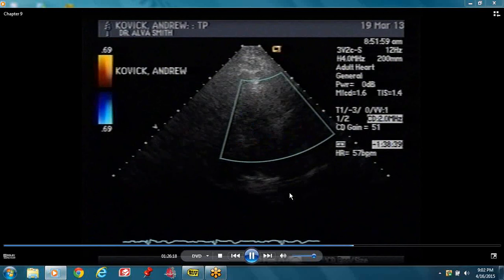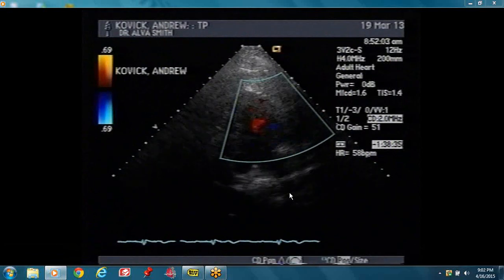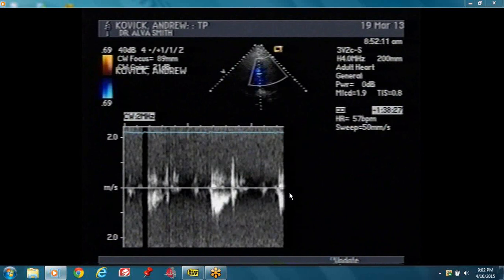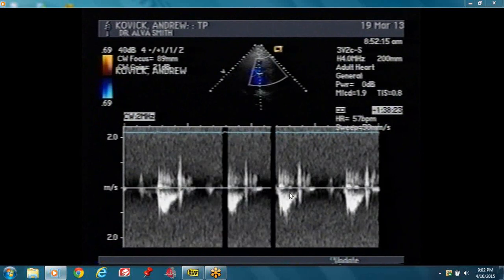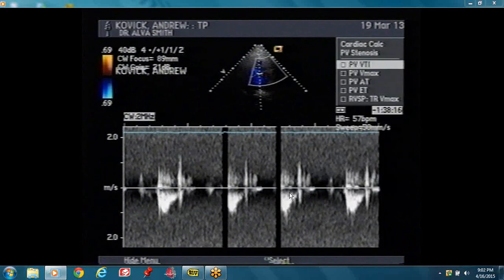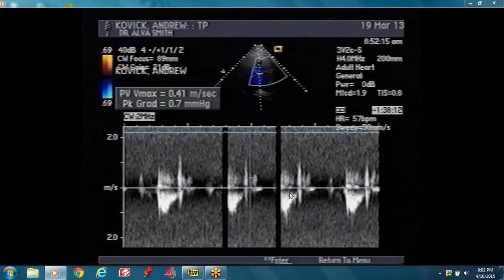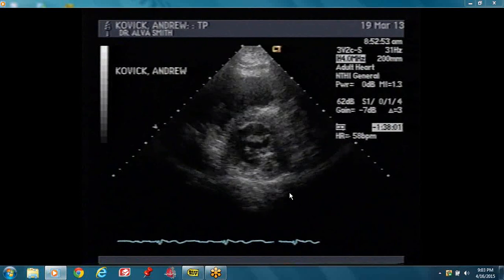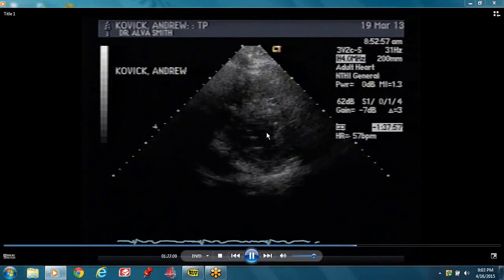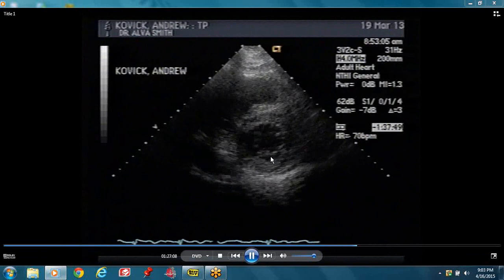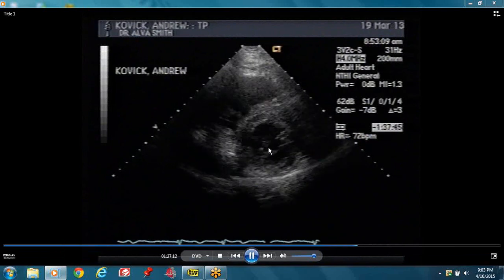This is a suboptimal study but you have to know what to expect and try and get the best pictures as possible. It's across the pulmonic valve and you're measuring the peak velocity — you must always trace the envelope to get your VTI. Short axis at the level of the mitral valve — level of the mitral valve, the anterior leaflet, posterior leaflet. See everything thickens with systole and thins with diastole.